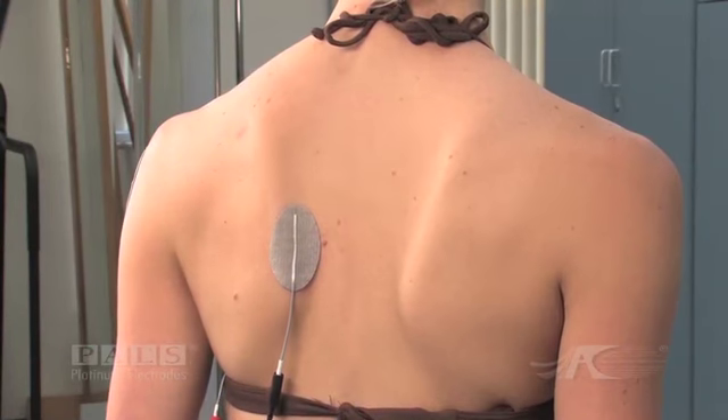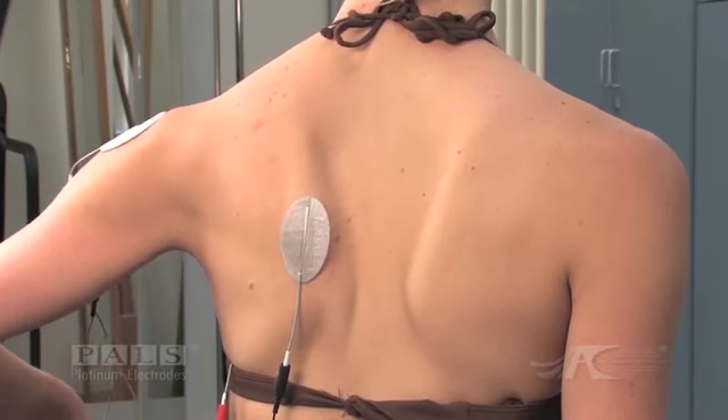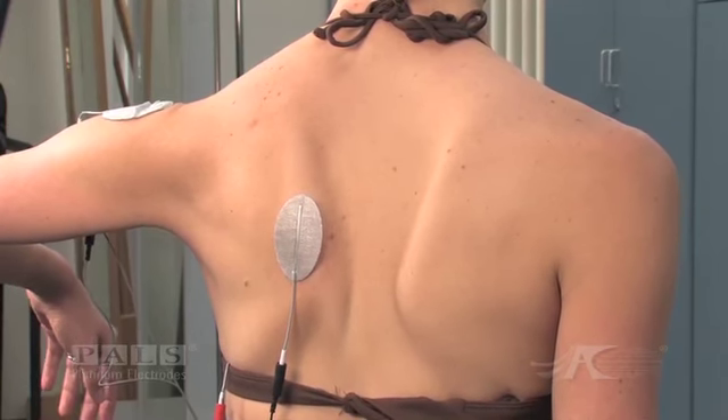Activation of the two channels together allows shoulder flexion to 90 degrees while maintaining scapular stability against the thorax.